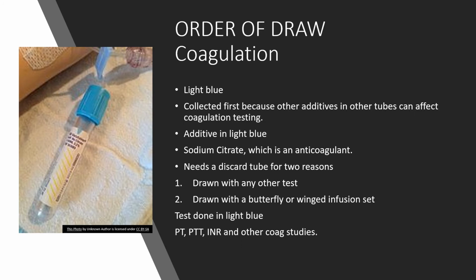Okay? So what are the additives? Like I told you earlier, and we'll go over this plenty of times, anything that is added to a tube is considered an additive, okay? Now the additive in the light blue top tube is sodium citrate, which is an anticoagulant, okay? As we know from medical terminology, anticoagulation, right? It prevents the clotting of the blood, okay?